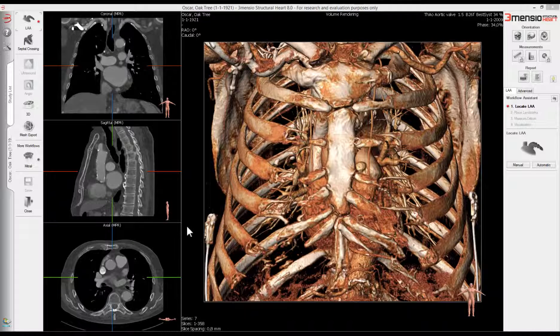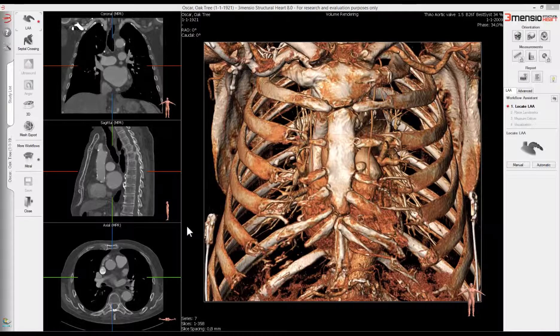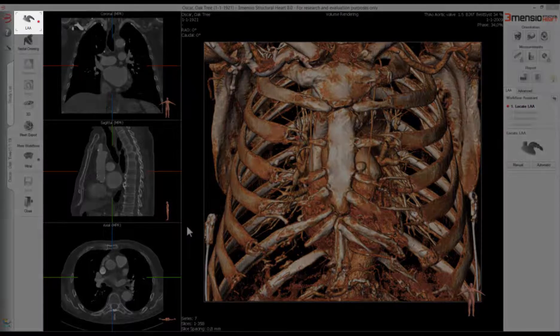CT images for LAA closures can be assessed using Tremensio for fast, accurate and reproducible treatment planning and sizing. To get started, open the dataset and select the LAA workflow.